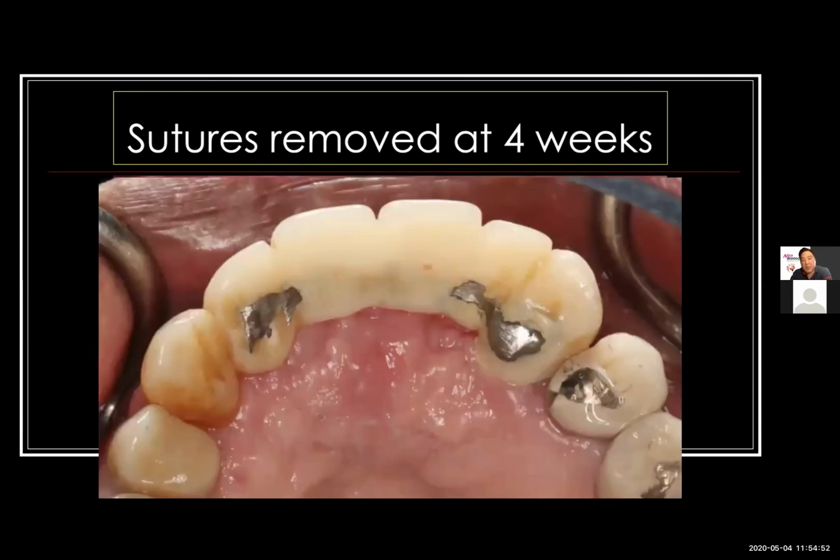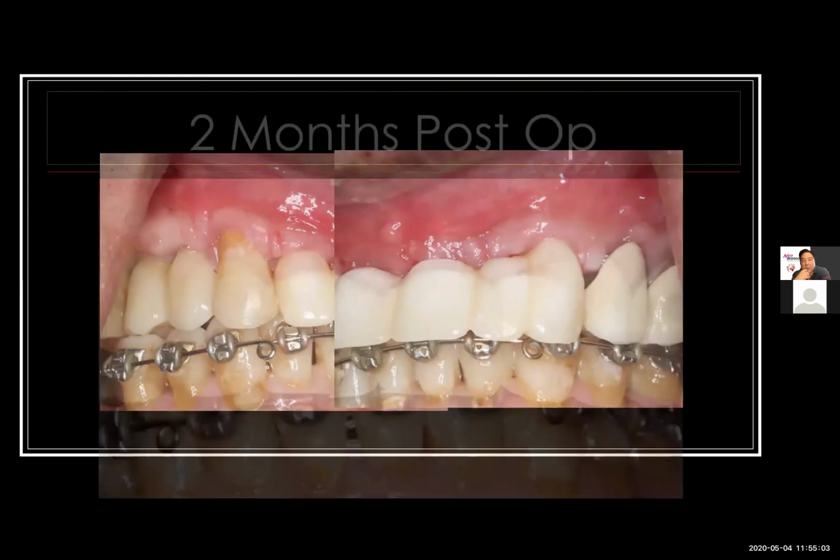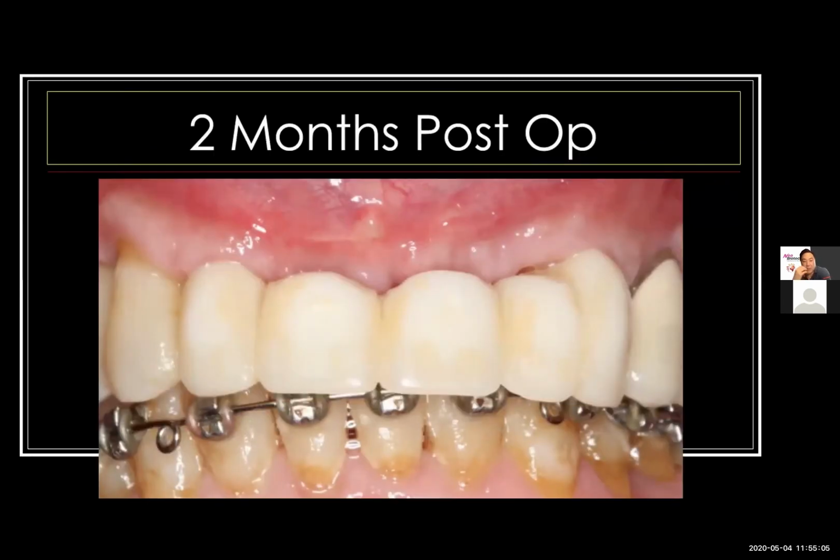And plus, I'm sure he took good care of it. Here's suture removal, look at the occlusal view. I mean, this is just fantastic, just incredible healing for this patient, right? Lateral views of the canine, lateral views. This is 2 months post-op. Again, still no flap breakdown.